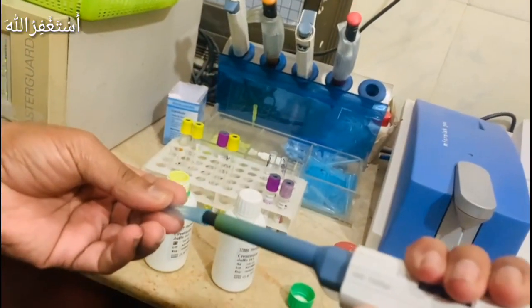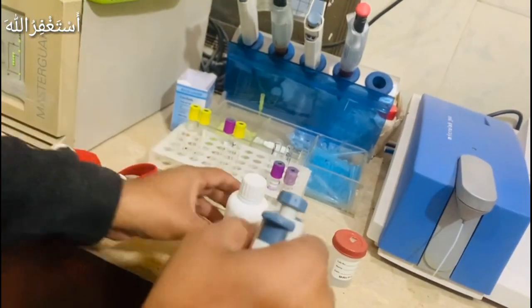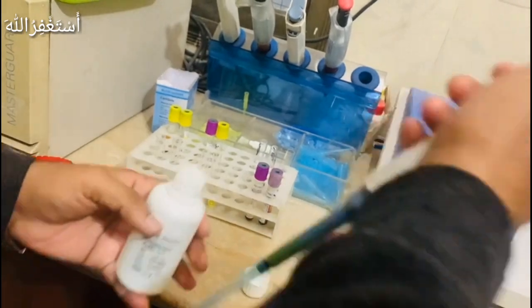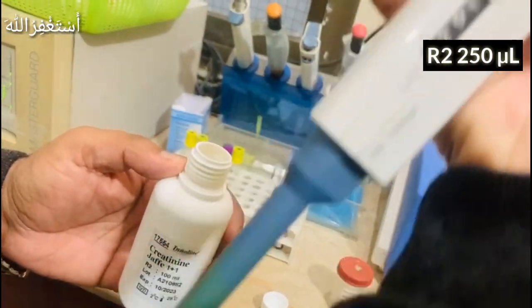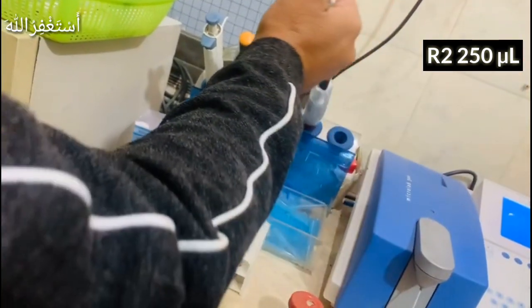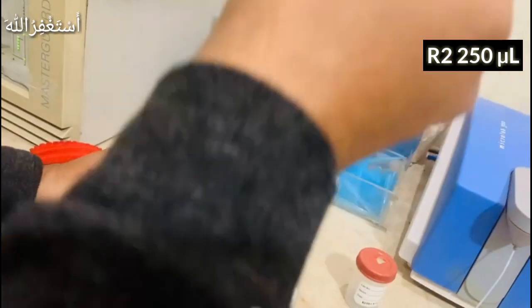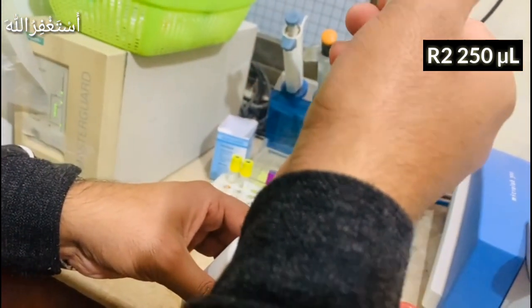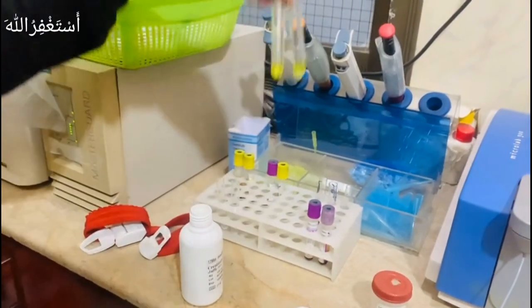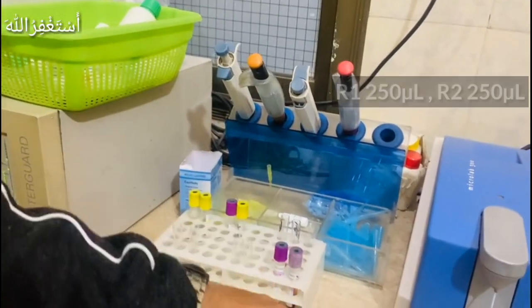We have two patients, so we have two tubes per patient — 250 microliters of R1 and 250 microliters of R2 for each.